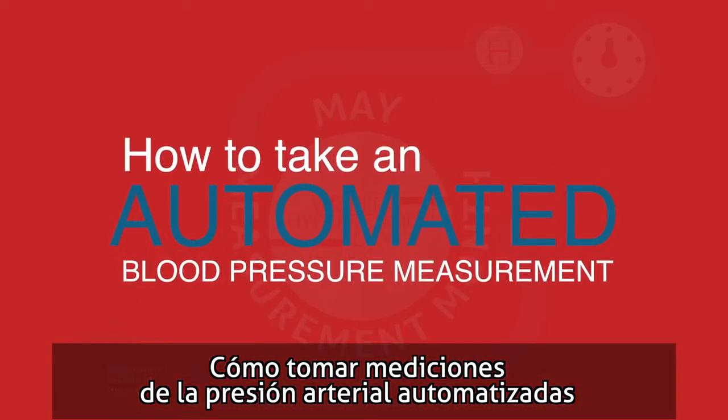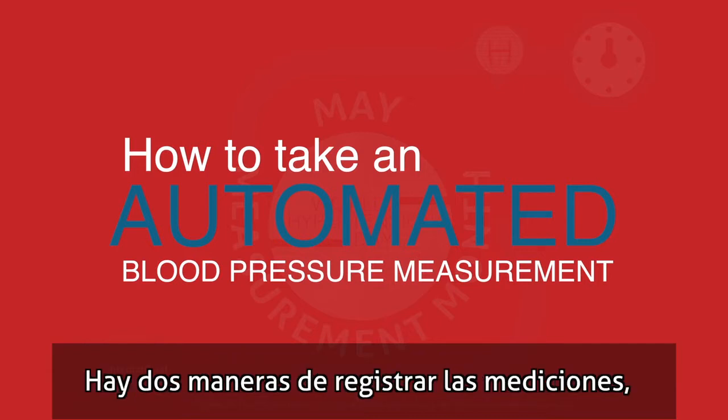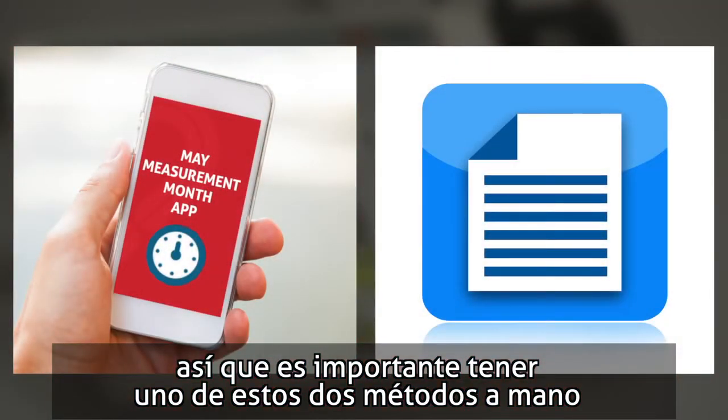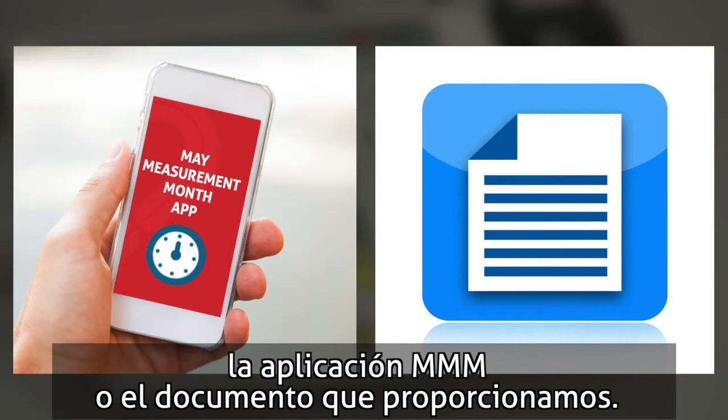How to take an automated blood pressure measurement. There are two ways to record the measurements you take, so it's important to have one of these methods to hand before taking any readings: the MMM app, or by using the document we provide.